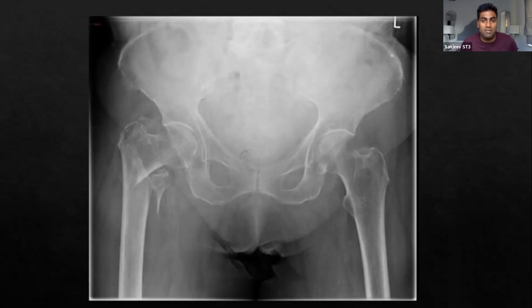So basically the take-home message with these MSK plain films is do not panic, keep it really simple, and have the systems that I went through at the beginning at your disposal. Don't forget to include really simple stuff. I know it's going to sound really annoying doing it again and again, but that's literally what the OSCE is there for. It's a tick box. Like a driving test, you just have to make sure you go through everything in your tick box like a robot. And at the end, once you've covered everything, even if you get the answer completely wrong, as long as you've gone through the system, you should be getting up to that point where you're passing.